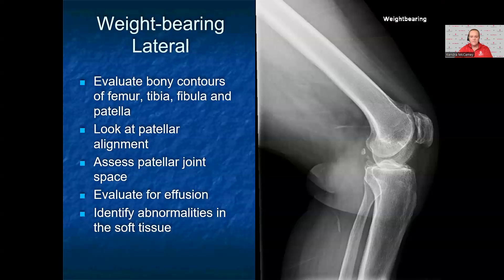Finally, look at the soft tissues for any abnormalities. For this x-ray, the patient has sclerosis and degenerative changes of the patellofemoral joint. There are also loose bodies in the posterior joint, and the patient has an effusion. The effusion is the black layer seen anterior and posterior to the femur.